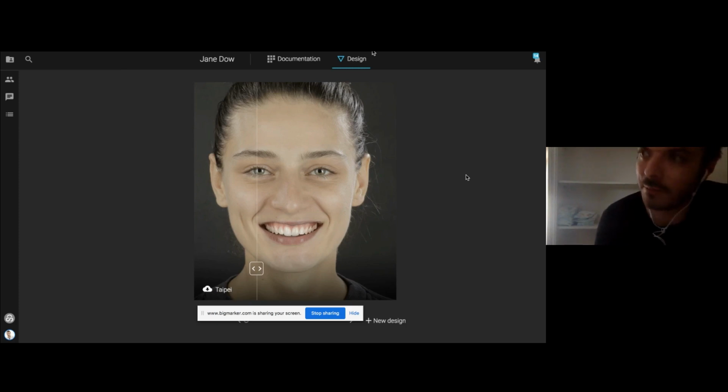Why? Because mockups, for example, we can properly do when the case is additive or borderline additive. If you have reductive cases, if you have ortho cases, if you have edentulous patients, all of these cases are difficult to create a mockup. And even if you do create a mockup in those cases, many times you're in the situation where you do a mockup, which is basically a scientific subjective guess, which you think will work for that patient.